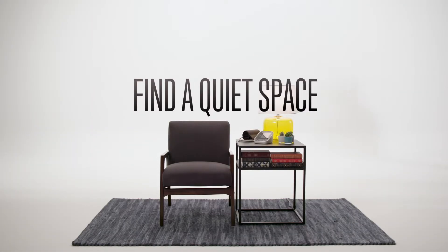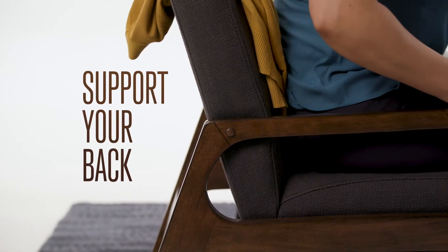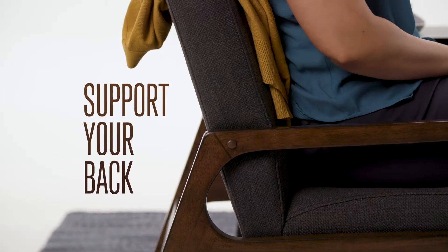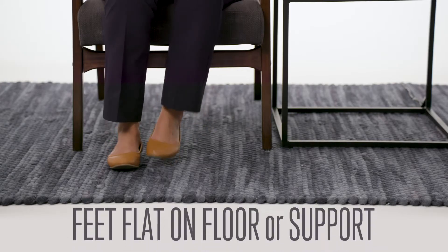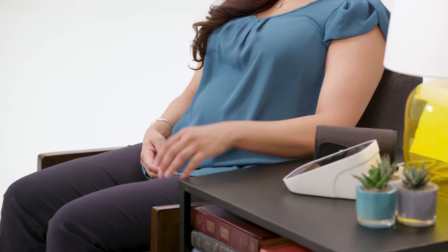Find a quiet space without distractions. Second, get in the right position. Sit with your back supported and do not cross your legs or ankles. Have your feet flat on the floor. If your feet don't reach, place them on a stool or other object so they are supported.